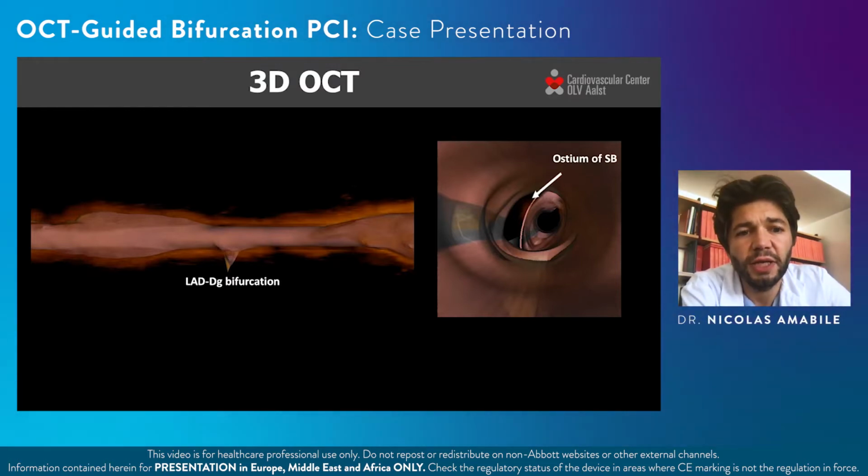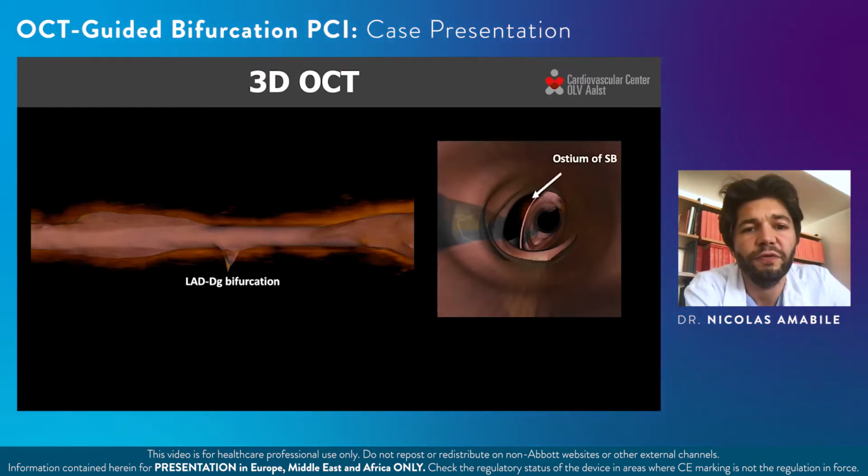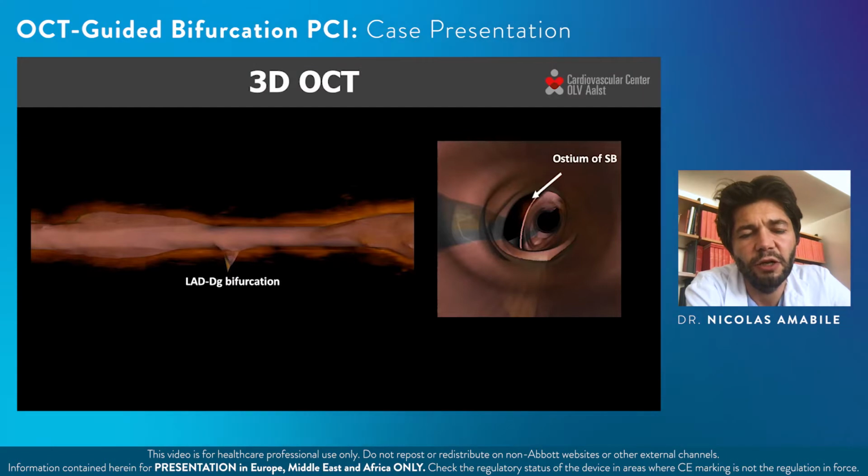Adrian, I think that's a great case. It's a very challenging situation, and my initial plan would be not to treat this patient with CABG, but rather do a PCI. Of course, the challenge is that there is already one layer of struts within the artery. So I would try not to put other stents in this previous stent, and maybe analyze the reason for the in-stent restenosis and potentially go for a drug-eluting balloon after OCT, and potentially also post-dilate the previous stent.